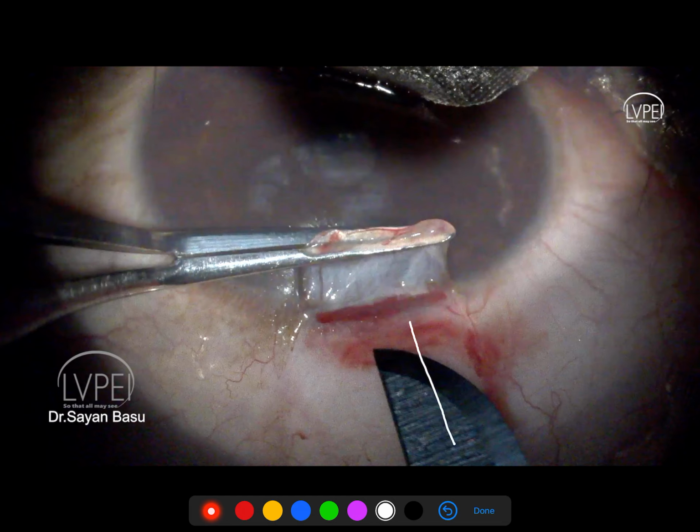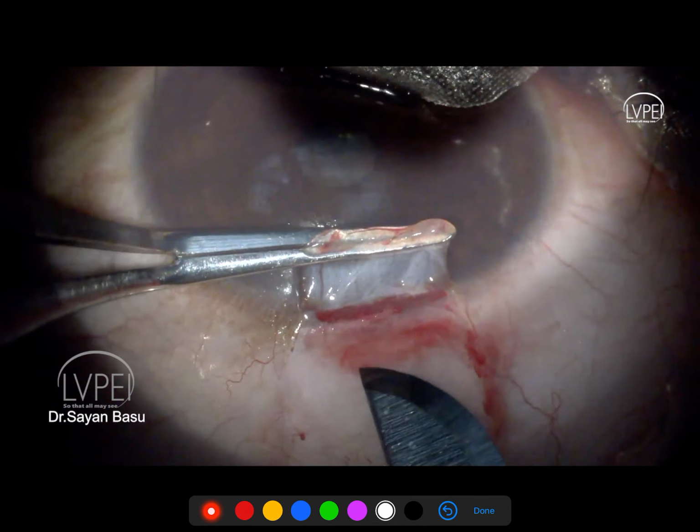So typically this is the sharp side. This is where the bevel of the blade is, whereas there is no sharpness over here. So some surgeons will, instead of dissecting in this direction, hold the blade and dissect in this direction. So use the blunt side of the number 15 blade, to have a more controlled dissection. It is just sharp enough for you to do a blunt dissection, but not sharp enough that you will buttonhole or that you will go too deep.